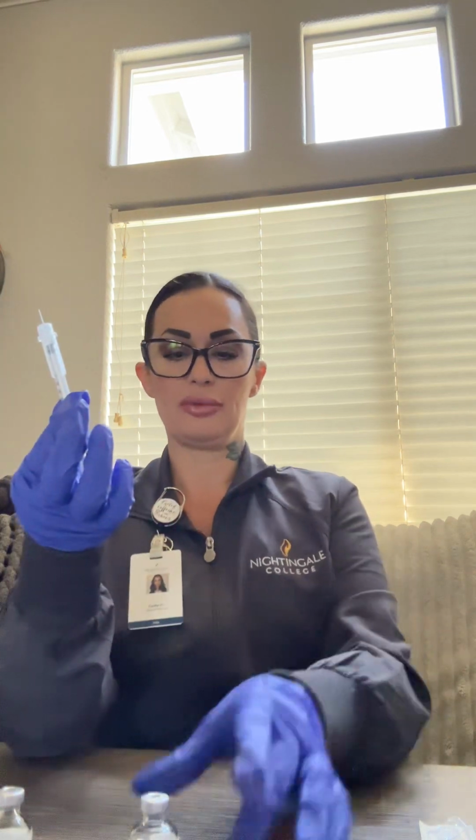So at this point, you have your regular short-acting insulin. You do want to confirm again the dose of the intermediate acting insulin, or NPH, by comparing once again to the EHR, which is 8 units. I always like to look and say, okay, I'm going to do the 12 units, which is the combined total of them both. So you add them, the 8 plus the 4, so you'll want the 12.